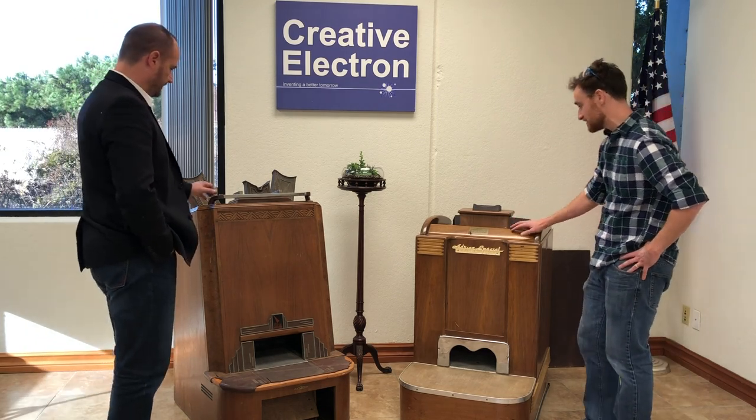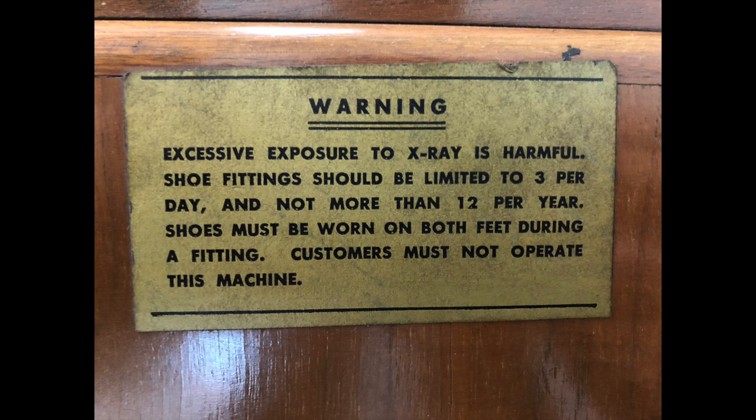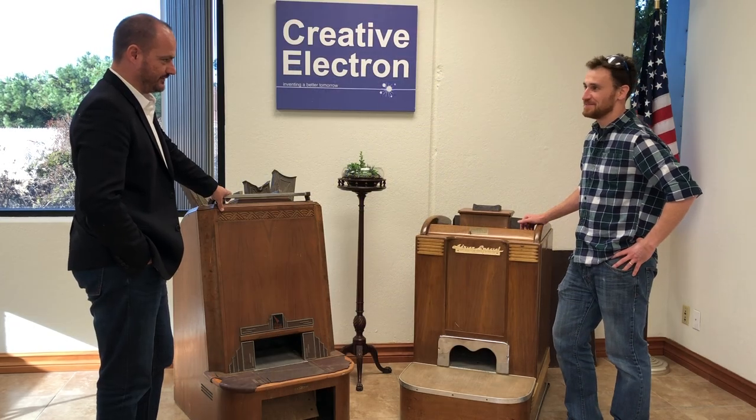In fact, it says right on this machine: 'Excessive exposure to X-rays is harmful, and shoe fittings should be limited to three per day and not more than 12 per year.' But that doesn't apply to the shoe salesman, right? Not at all — just the customer.